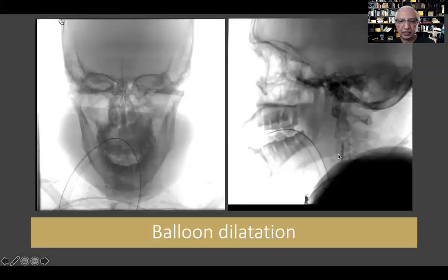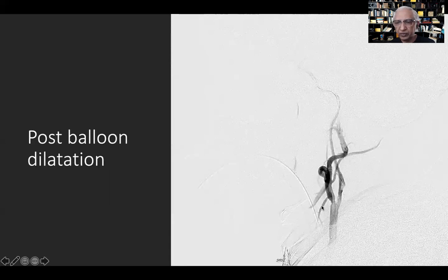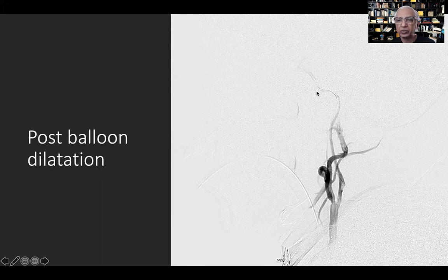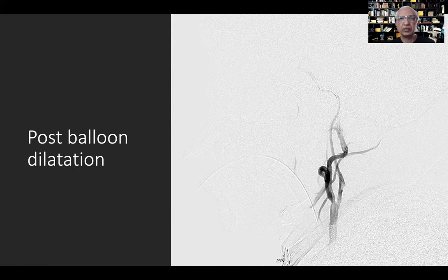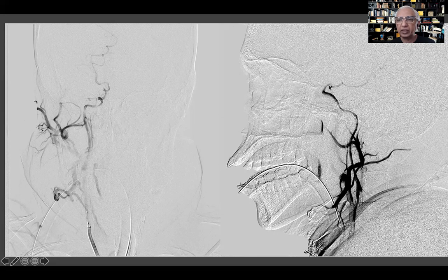On the lateral view you can see the balloon — a 4mm into 15mm balloon — used for dilatation. On the AP view the long sheath is out here and the balloon is up there. After pre-dilatation we see some opening and interestingly some forward flow going up, so most of the ICA opens. Very often what looks like a complete ICA occlusion is probably just proximal ICA occlusion with an associated tandem MCA occlusion — that's why we see ACA filling but not MCA filling.